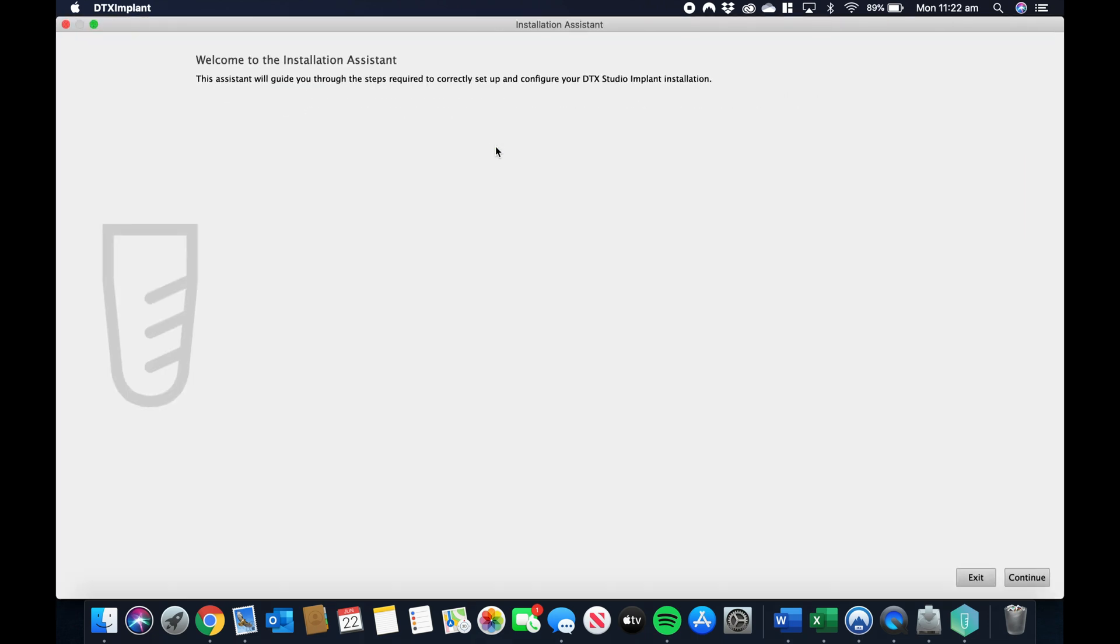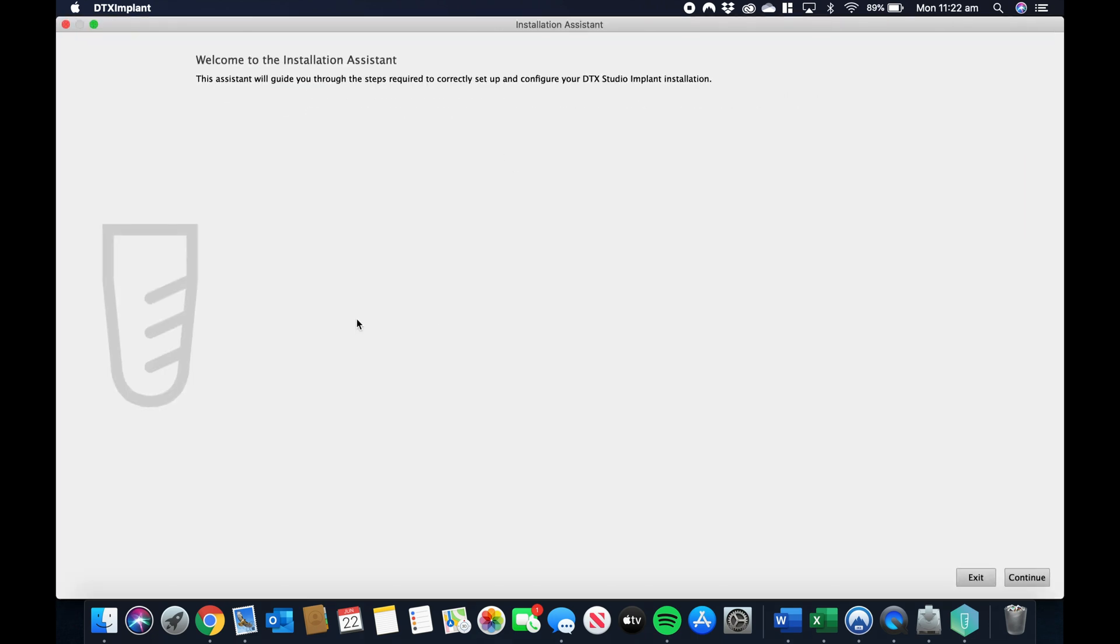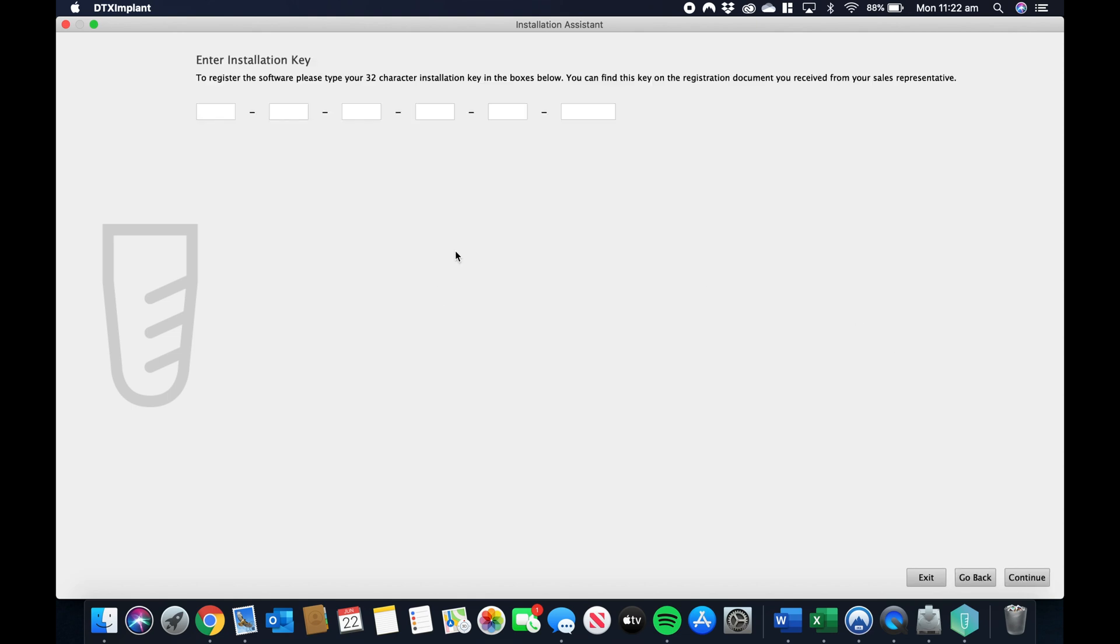Just press continue and follow the step-by-step installation process. You're going to need to copy and paste your key that we found earlier, press continue, select the disk where you want to install the software in.